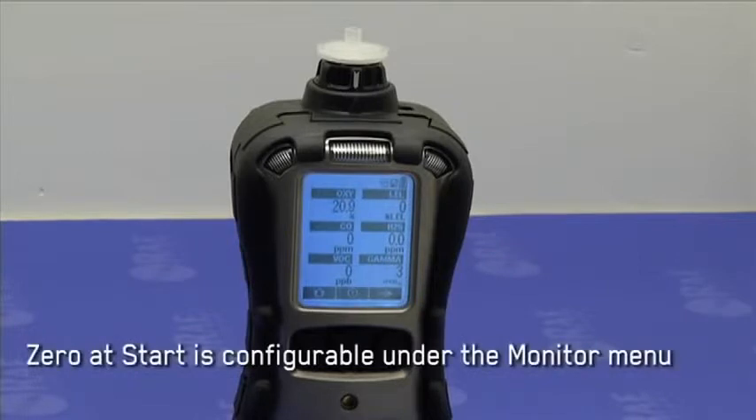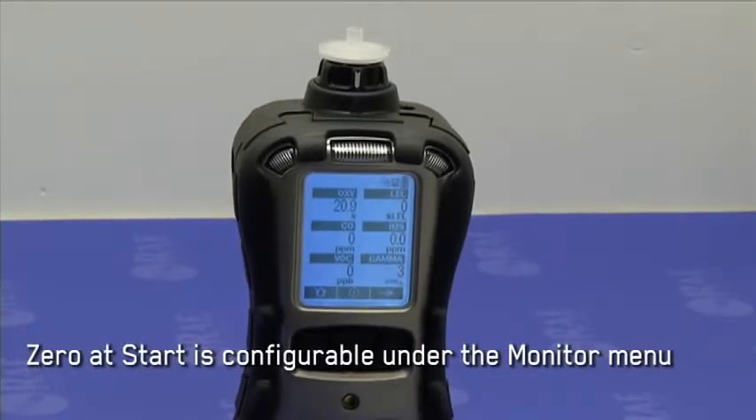This option is called zero at start, and it's configurable under the monitor menu of the programming mode.